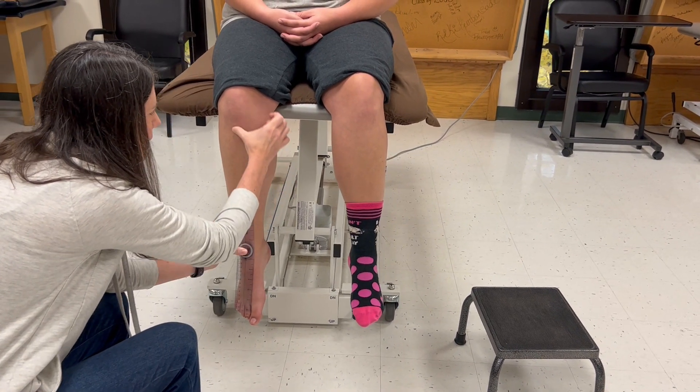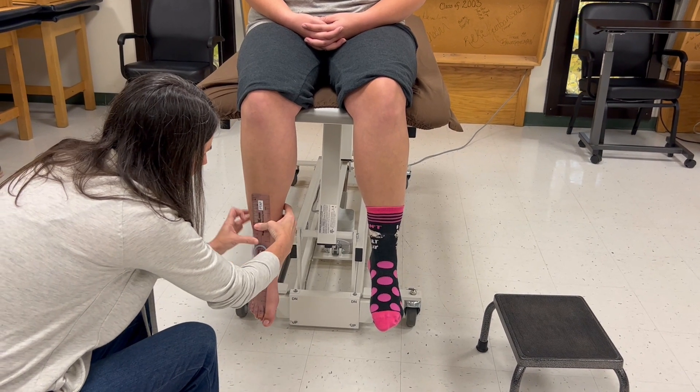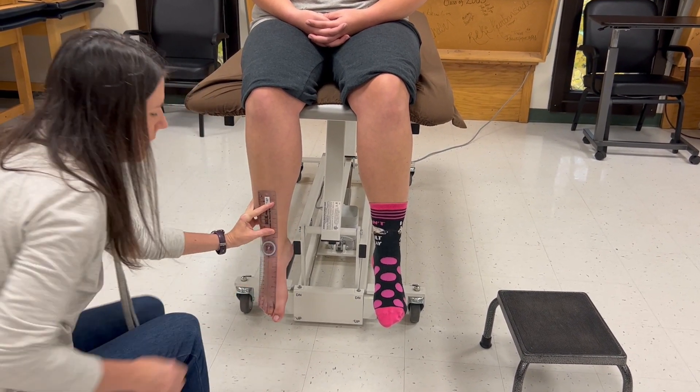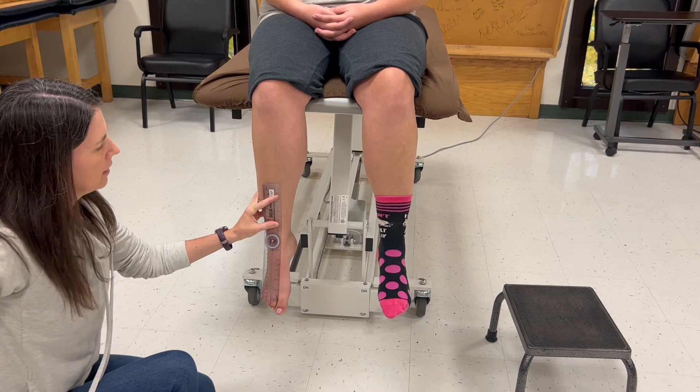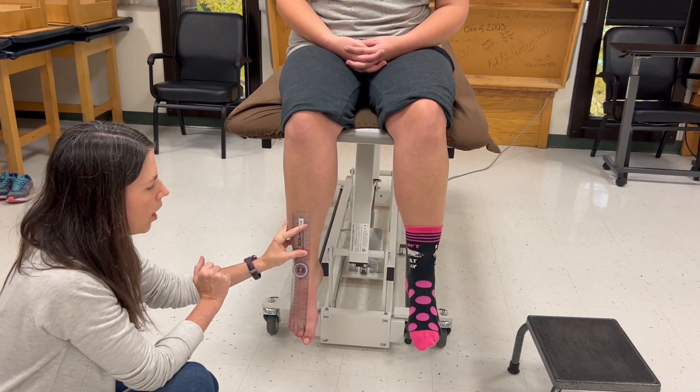The stationary arm goes up to the tibial tuberosity, along that tibial crest. I'm going to put two fingers on here so that I don't create a new pivot point and so that all the work I just did setting up my landmarks isn't lost.